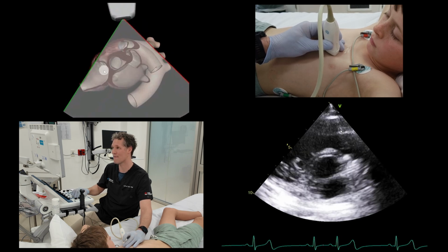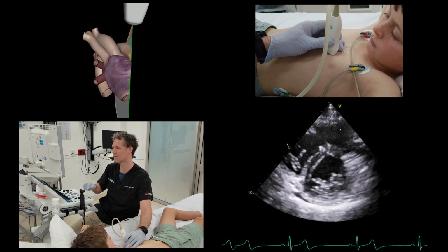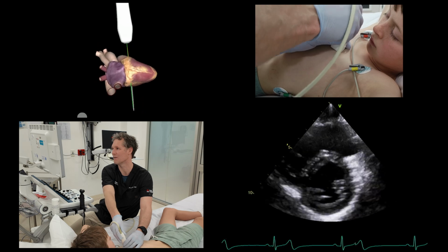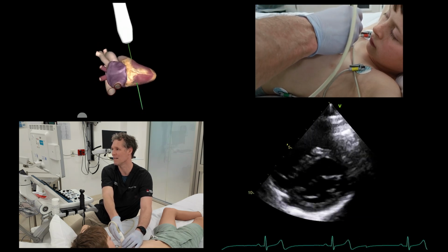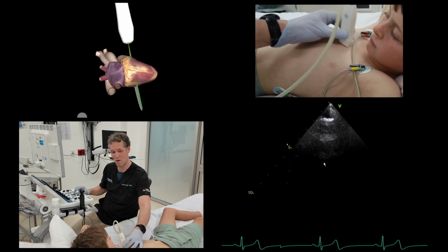I can start fanning down through the structure, and there's the mitral valve. See if I can just get a little better on axis. There we go. Just came up a rib space. I'm just tucking myself in next to that parasternal space, trying to make the ventricle look as circular as possible, trying to make sure that I'm not off axis.